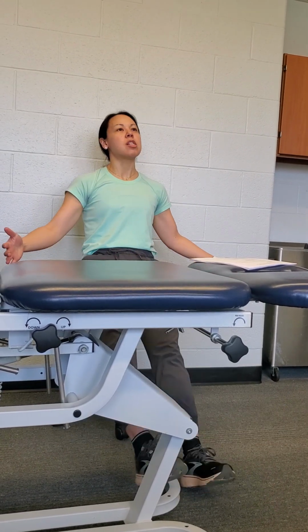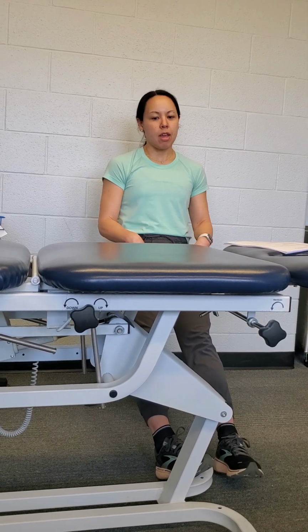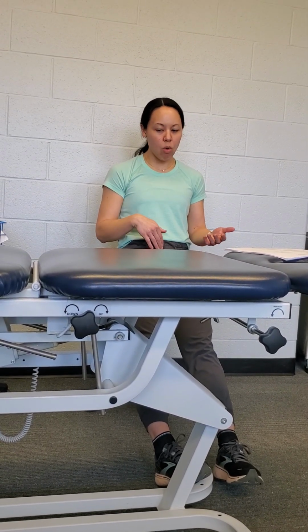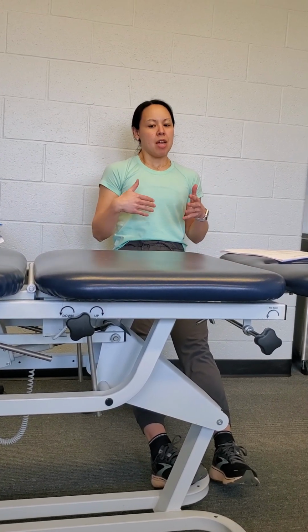Say they're literally just lying there, they're post-op day 3, let's say, and they are in so much pain and have a lot of swelling, and you're just doing it to get that physiological response. Then they could be doing ankle pumps or quad sets, and you can get away with it there. Or if they're literally just lying there and doing nothing, then you can't technically charge for that.